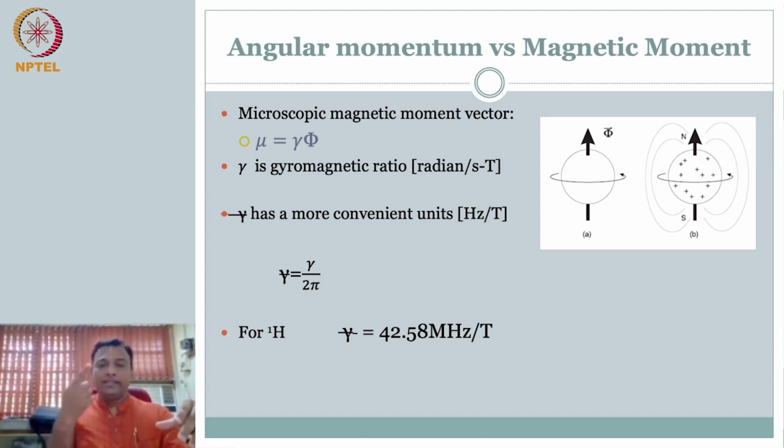But essentially this is a frequency of precession. And what does this say? It means that if I have a known magnet and a known ability to measure the frequency, then maybe I know it is hydrogen. So we'll build on this material.